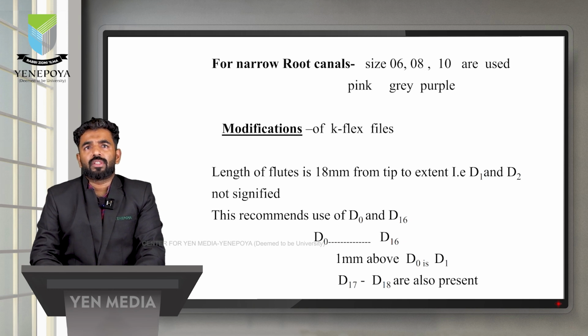For narrow canals we use number 6, number 8 and number 10. Number 6 is pink, number 8 is grey and number 10 is purple.